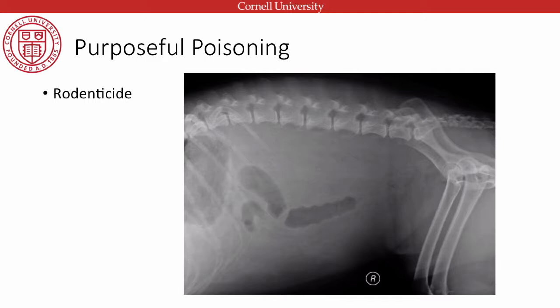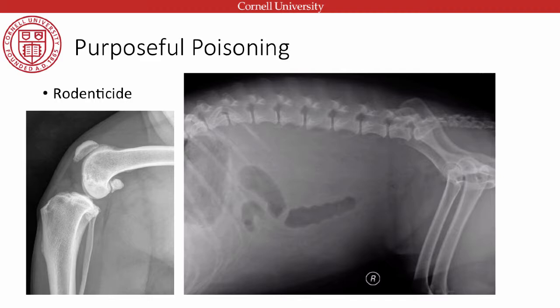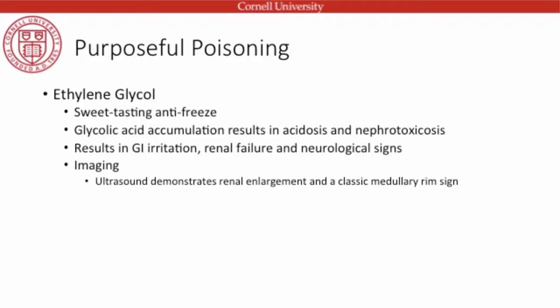This rodenticide case shows heme abdomen — loss of serosal detail with a pendulous abdomen, confirming effusion rather than a thin animal. This is heme abdomen secondary to rodenticide toxicosis. An example of joint effusion in the stifle shows swelling cranially displacing the fat pad, similar to what you'd see with a cruciate injury. The stifle nicely delineates effusion, allowing us to confirm hemoarthrosis in the joint. In the tarsal joint you may see bulging of the joint capsule as well.